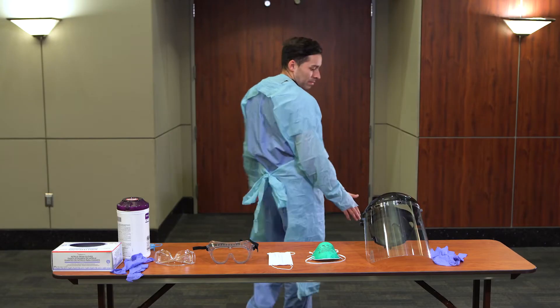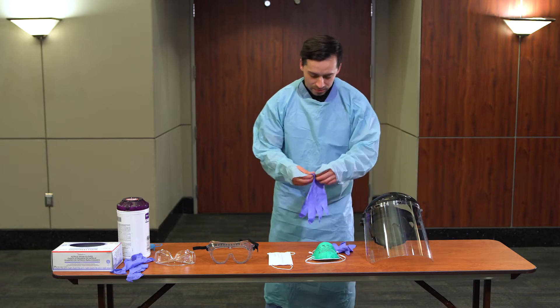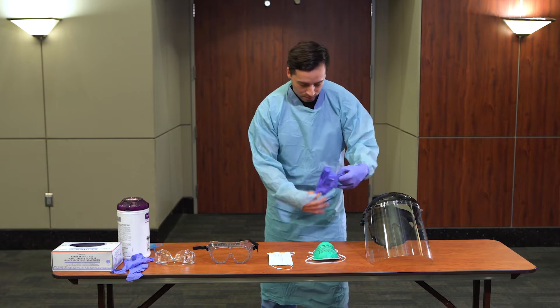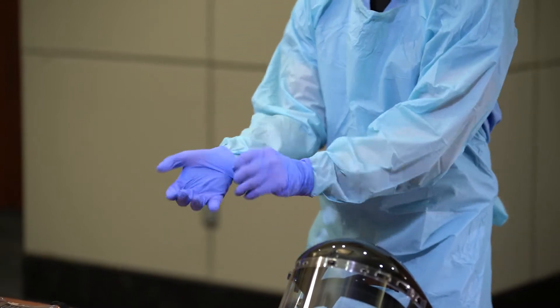Don gloves. The purpose of gloves is to ensure the reused N95 mask is kept clean for the next use. Gloves should not be too tight or loose. Tight gloves could potentially tear, and loose gloves will hinder your ability to perform certain patient care tasks and may come loose.